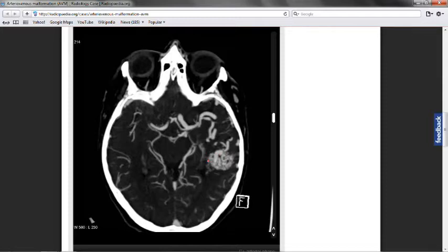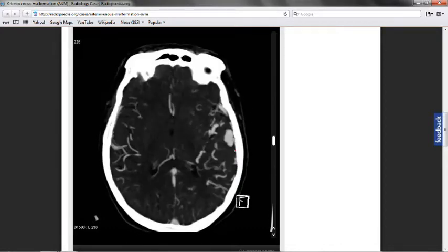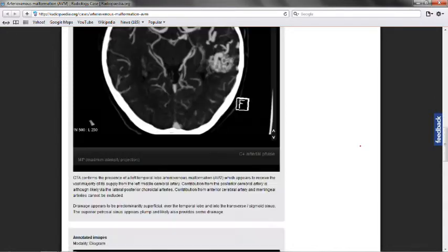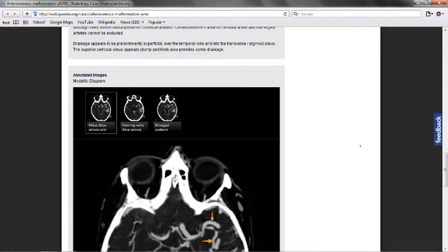And that's what we see here, just a tangle of things, or a tangle of wire or something like that. And as you can see, you have individual vessels, but it's all just wrapped inside this big ball. And so that is typically what your AVM looks like. And also it causes this abnormality here as a result of the tangle here.